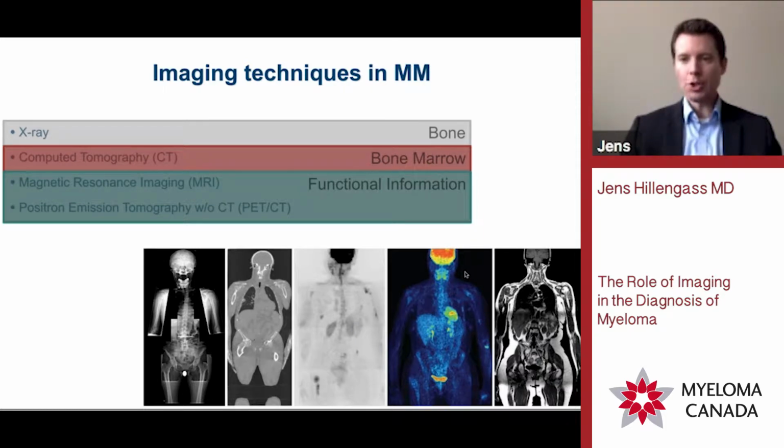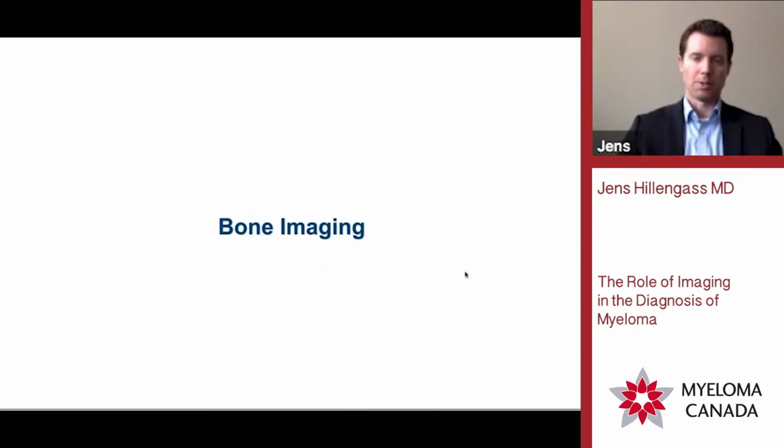and also functional magnetic resonance imaging techniques, and I will show you what I mean by that, can show more information than just the morphological changes in the bone marrow. Beyond that, we can also see some changes like microcirculation, if there's a lot of blood vessels in the bone marrow, for example. This is what we can learn from imaging: bone marrow, and further information, not restricted to the morphology, but also functional information.